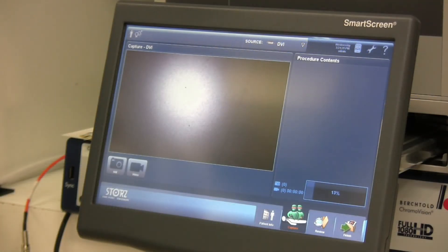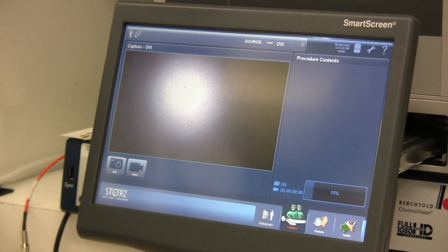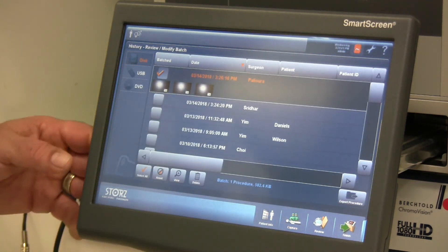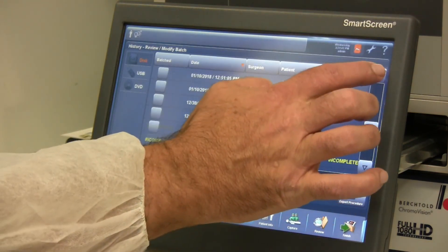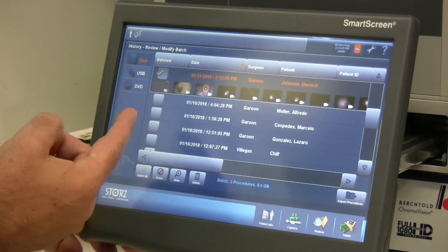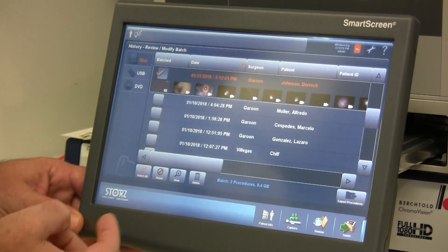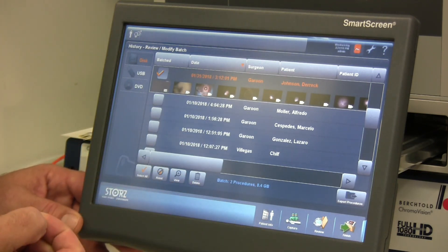Now we're going to talk about reviewing history and previous cases. We're able to access those cases, review them, and delete them from the hard drive on the image capture device. By pressing the file cabinet icon on the top right-hand corner, I'll get all the cases stored on this device. If I select a case to view, it will pull up all the images and video clips associated with that case, and I can view them or delete them from the hard drive.